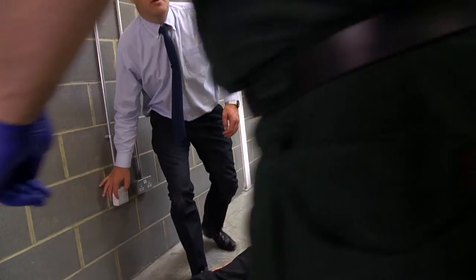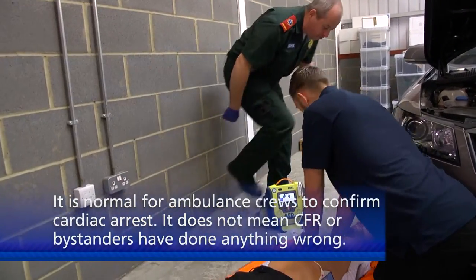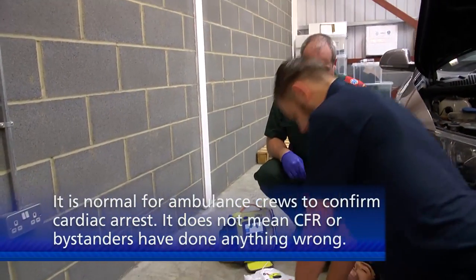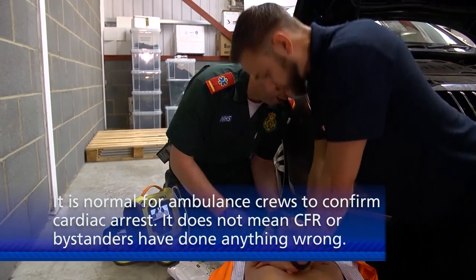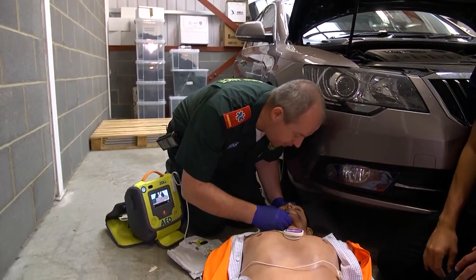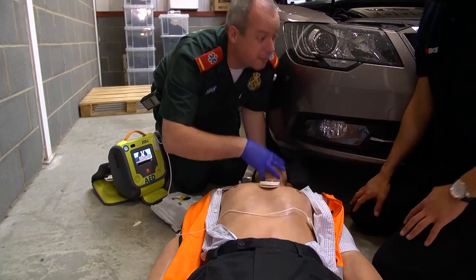Jimmy, can I just swap places with you? Sure, just so I can do a couple of checks. No problem. You just keep doing what you're doing. Hiya, I'm Steve. Hi, Nathan. Okay, Nathan, when I say it, I just want you to stop what you're doing just while I do a couple of checks, all right? So just stop now, please. Okay, so airway's nice and clear. No breathing, no pulse. Just carry on what you're doing, Nathan.